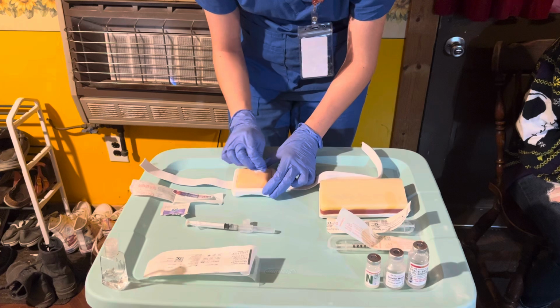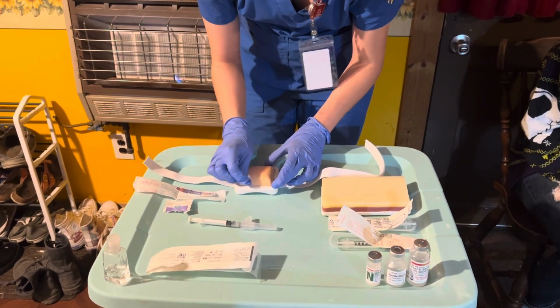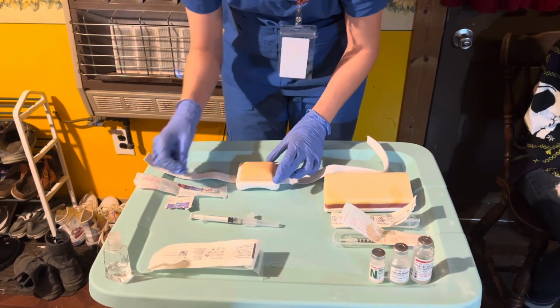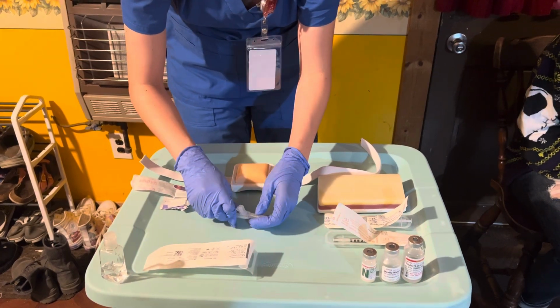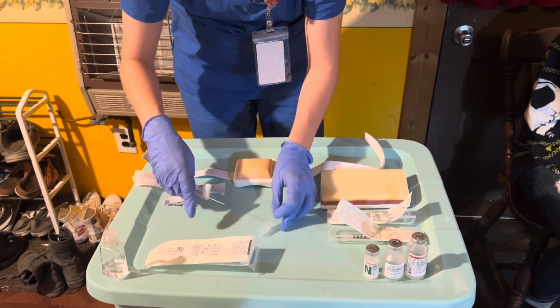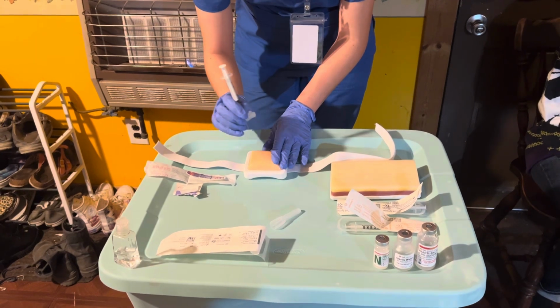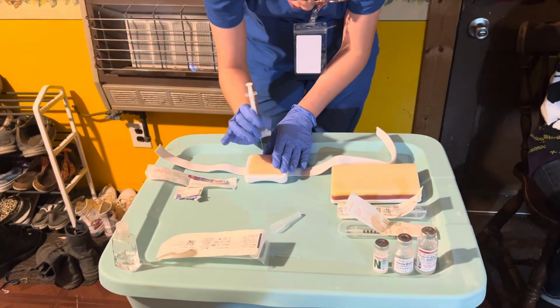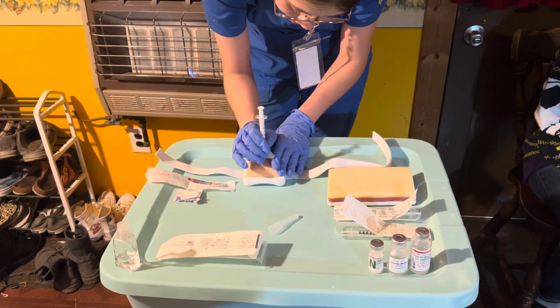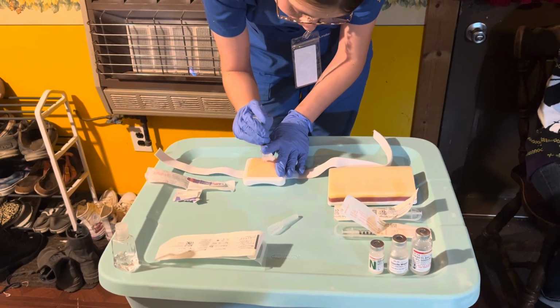You would insert this at a 90-degree angle, like a dart, perpendicular to the body. You're going to clean from inwards to outwards with an alcohol prep pad. And there's 2 ways to administer the medication effectively. The way I'm going to be demonstrating is a Z-track method. So you're going to take your 2 fingers, pull up on the skin, holding the needle with your dominant hand. You're going to put it straight in like a dart. You're going to grab what you can and then administer the medication over the allotted time.